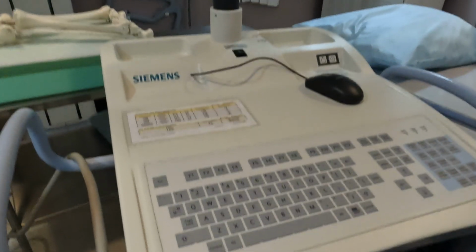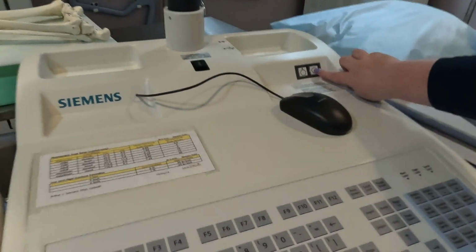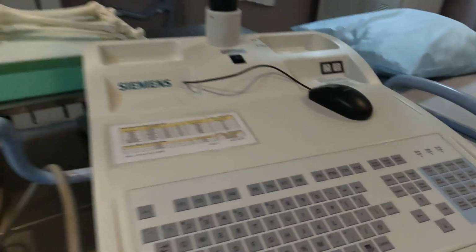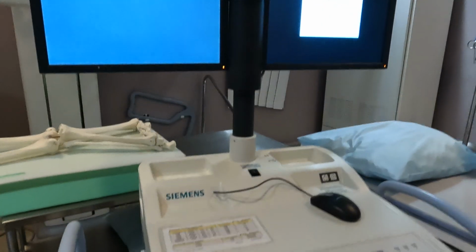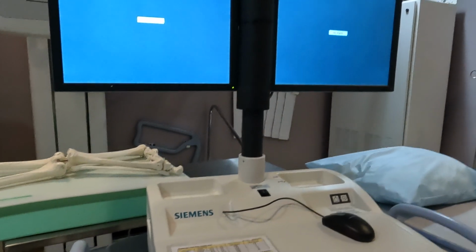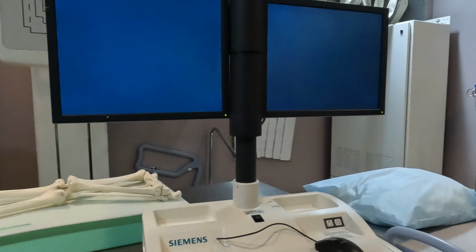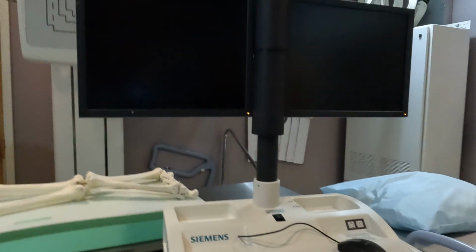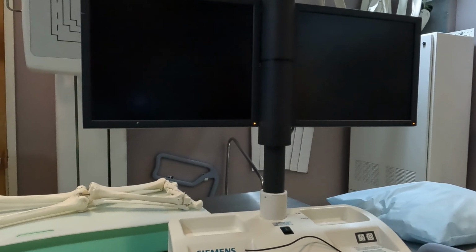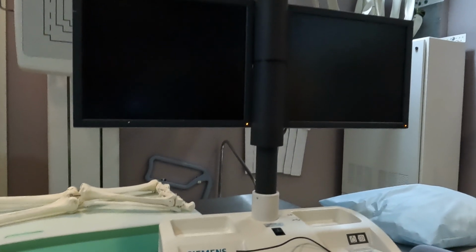Alright, once it's plugged into the wall, you're going to turn it on by using this button right here. So it'll take a couple seconds to turn on. If this was shut down as a hard shutdown, it would take about a minute or two to turn on with a countdown on the screen. But because this was just hibernating, it's going to come on very quick.